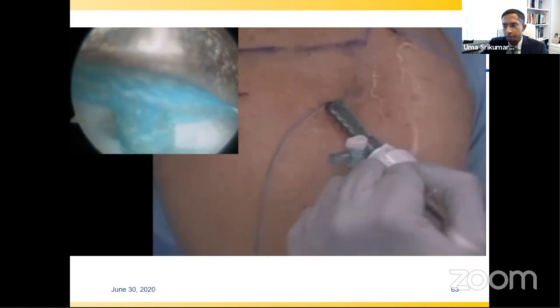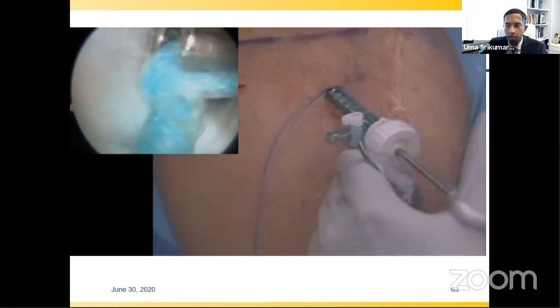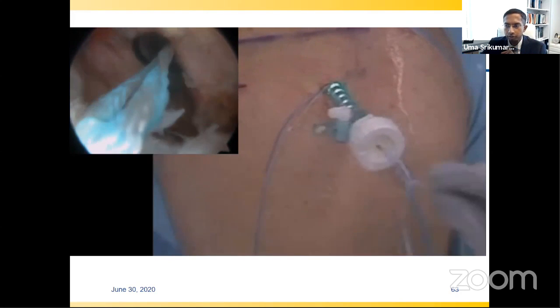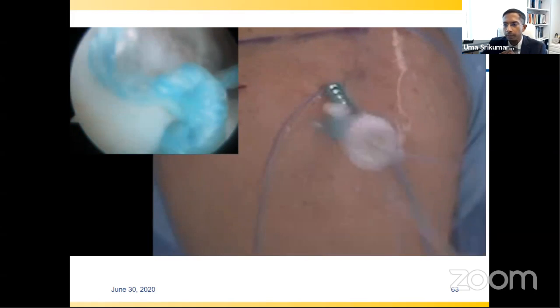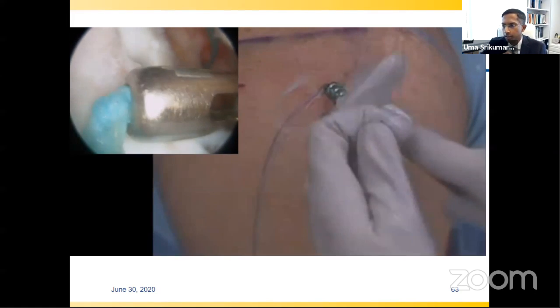This is the tape that we're using. I like to place that one first, again, as a strategy to protect yourself from suture cutout. Now the tape is lining the tunnel and helps protect future sutures from cutting through any bone. So the suture knot is cut, and we proceed to our next suture.